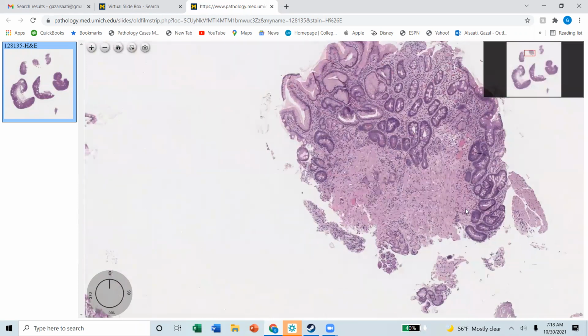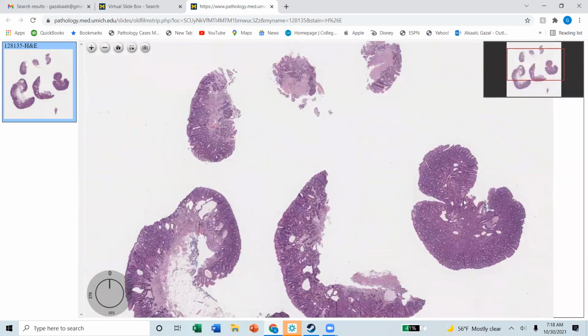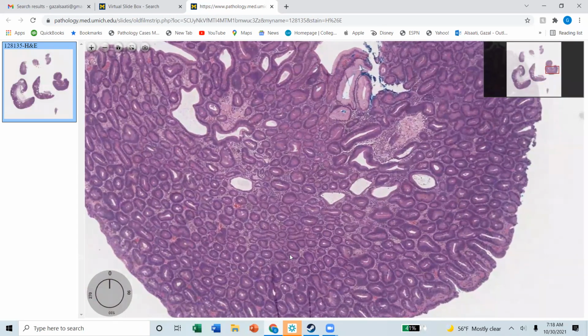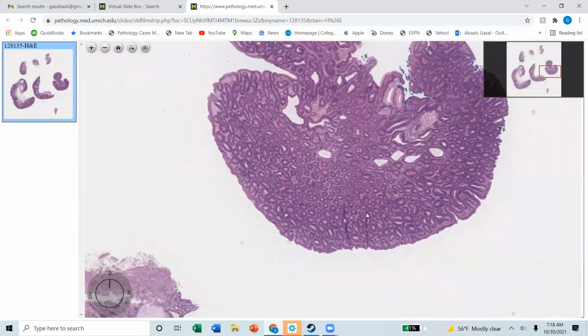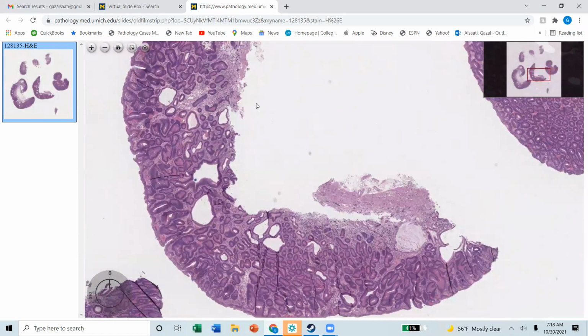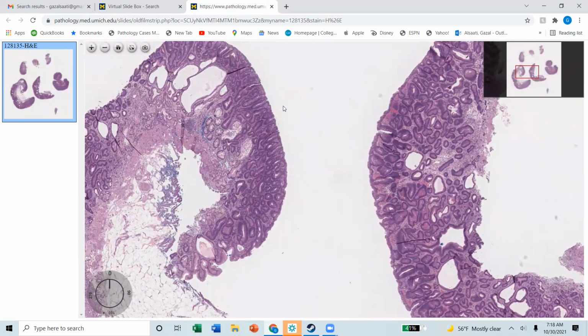Okay, now they mentioned that there is intestinal type, gastric type adenoma. Okay, this one, if you don't know, it's a stomach. What would you call it? Tubular adenoma. Exactly, exactly. And this is the exact definition of the intestinal type adenoma. And it's just a gastric adenoma.